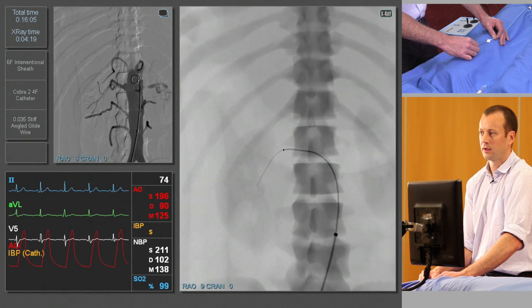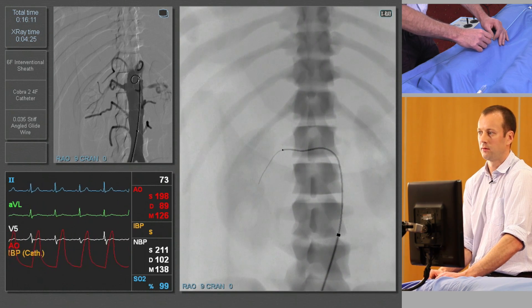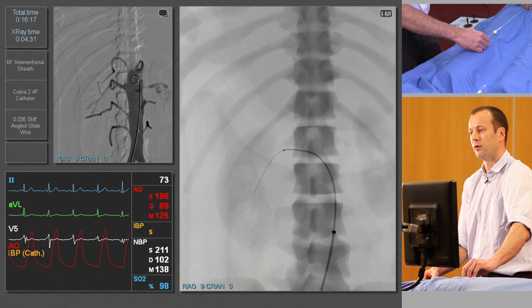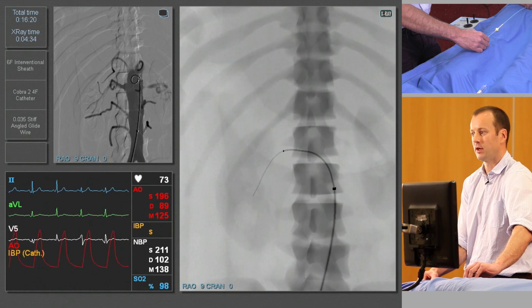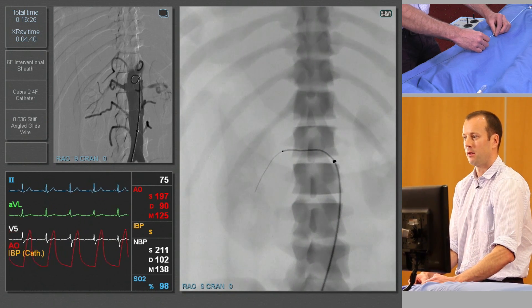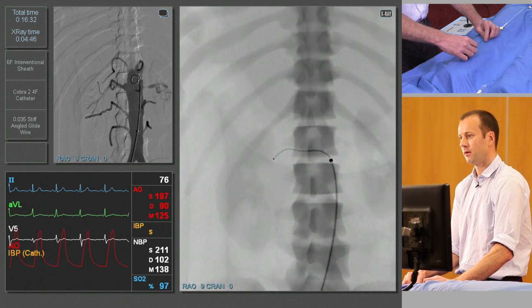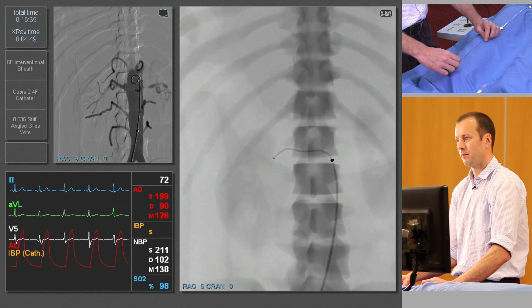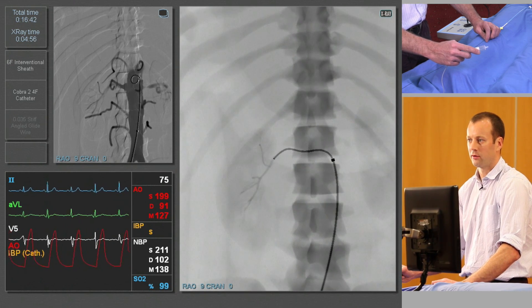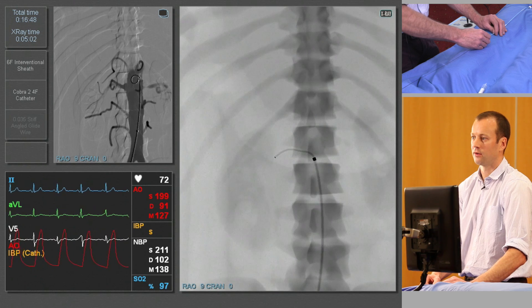Gently advance the catheter — you might need to torque the catheter a little bit. At the moment the catheter doesn't want to advance, so we can see whether by giving it more support from the sheath we'll allow the catheter to go a little bit further into the vessel. At this stage we'll remove the guide wire. Just a small injection of contrast to make sure we're not impacted into a small branch — and we are, so we'll just withdraw the catheter a little bit. You can see it deflecting the sheath first.